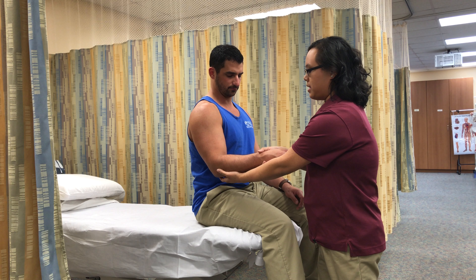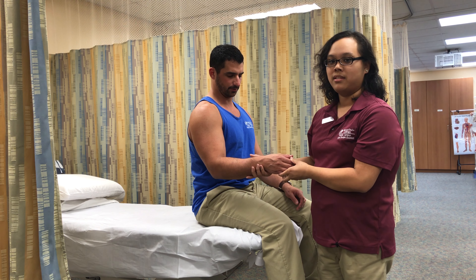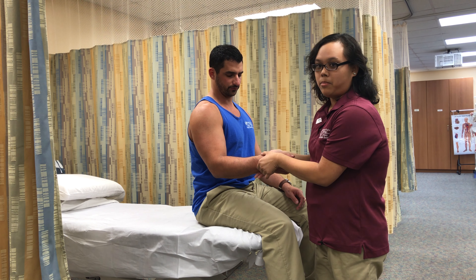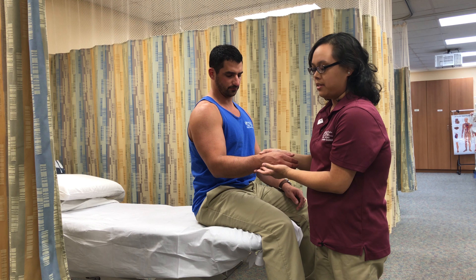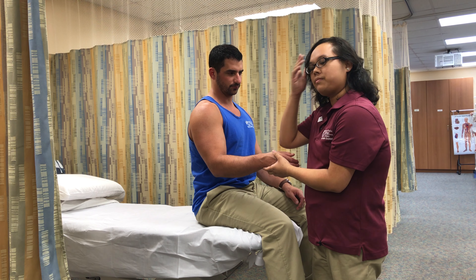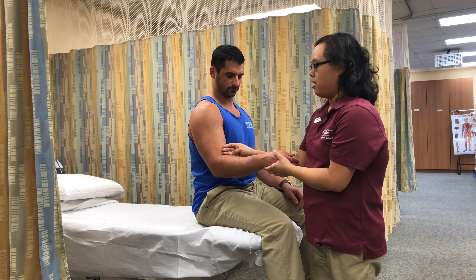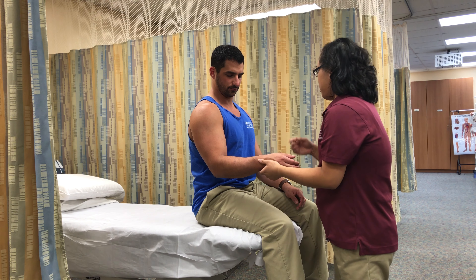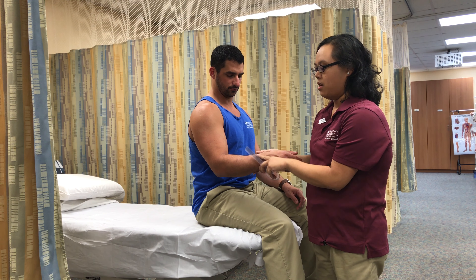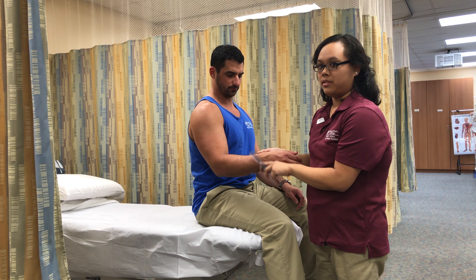Then I'll return them back to the testing position. I'm going to palpate the anatomical landmarks — that would be the styloid processes of the ulna and the radius. The proximal arm will be on the anterior midline of the humerus, and the distal arm will be on the dorsal aspect, just proximal to the styloid processes.